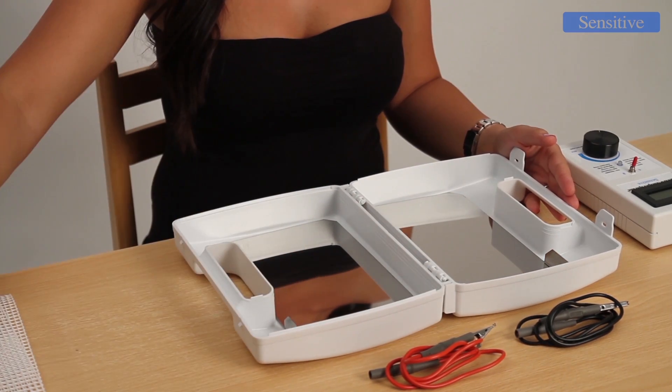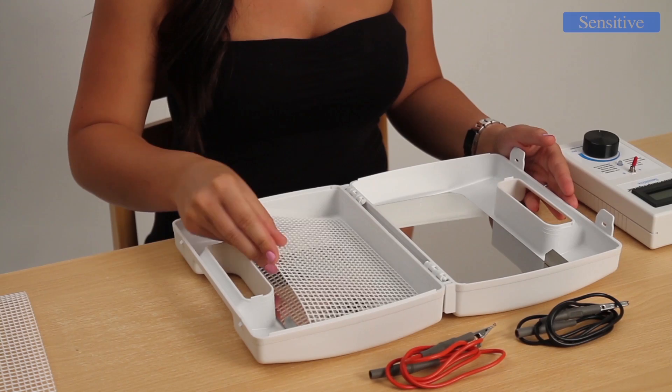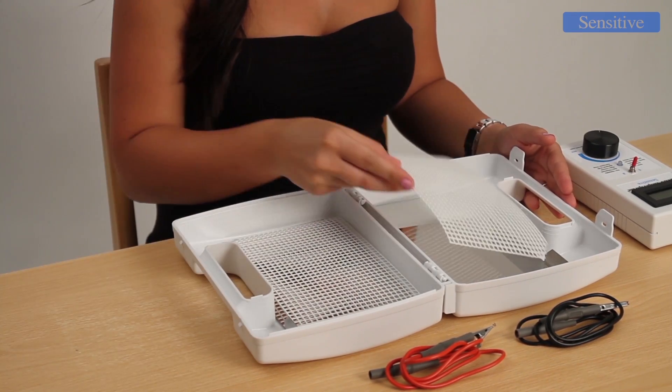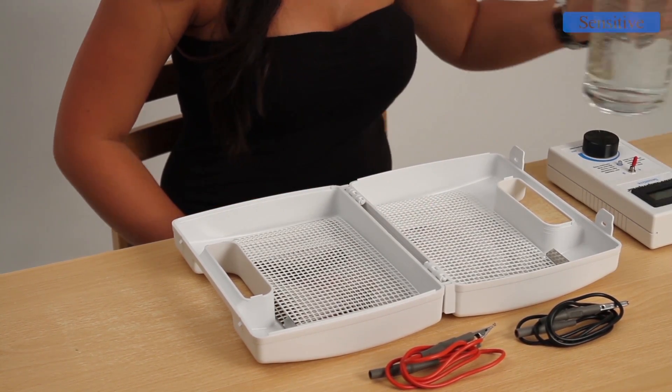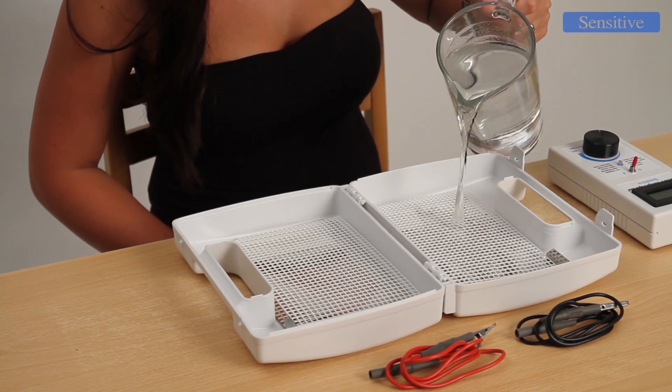Electroantiperspirant Sensitive may be used in patients of all ages. Read the instructions very carefully — you can find a lot of useful advice. Compliance leads to a rapid and effective stop to excessive sweating in the treated areas.